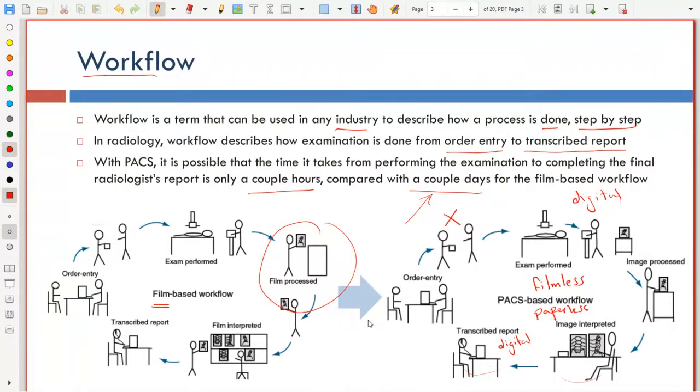Okay, so whenever you think about a particular solution, you have to think about workflow and how it will be affected. If there is a learning period at the beginning for everybody to get into gear and learn how the new system works, and after that it will be working smoothly, you have to prepare them, at least psychologically, for the learning curve and for the initial bumps in the road, and after that you promise them that it will be much smoother. Okay, but this is really important.